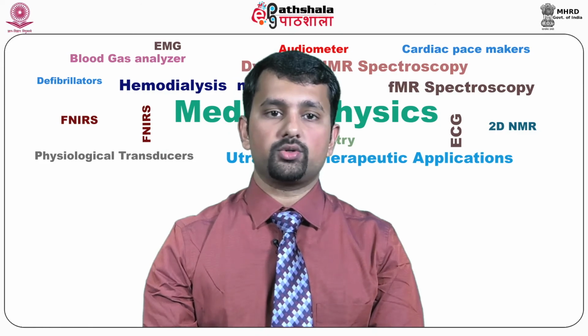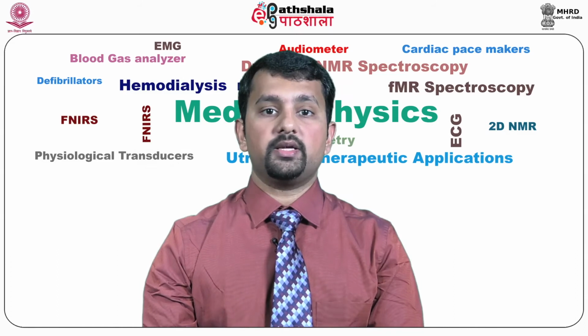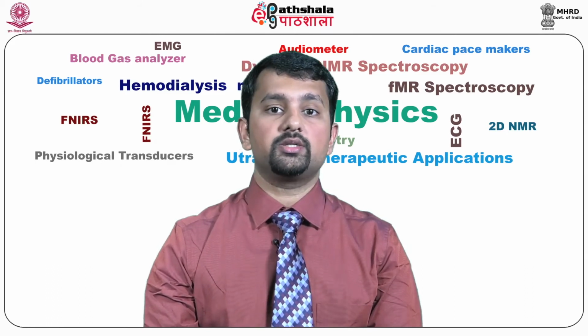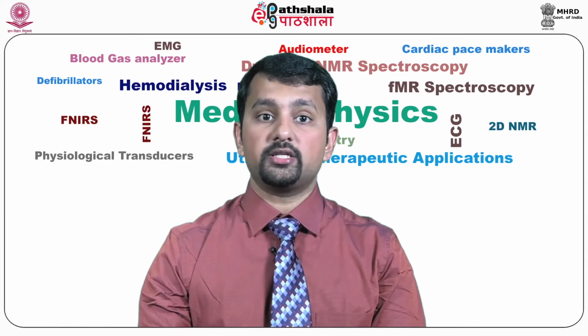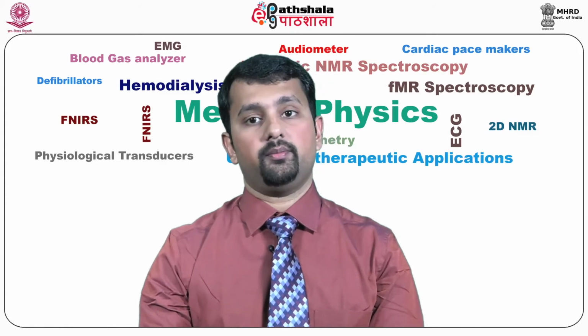Proton MR spectroscopy is a very good supplement to MR breast imaging, which significantly increases the positive predictive value of biopsy as well as decreases the number of biopsy recommendations for benign lesions with non-mass enhancement. It has also applications to monitor or even predict response in treatments in patients undergoing neoadjuvant chemotherapy.